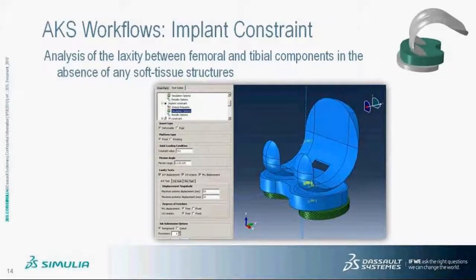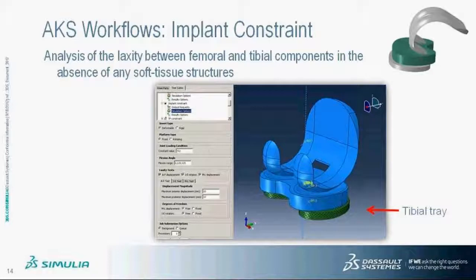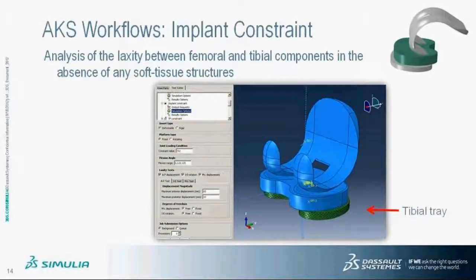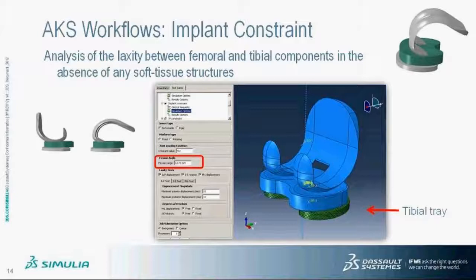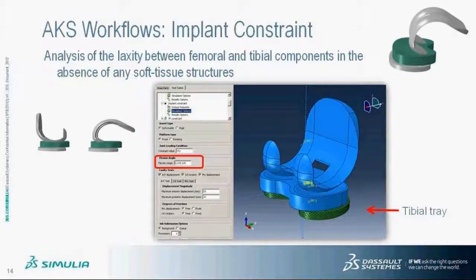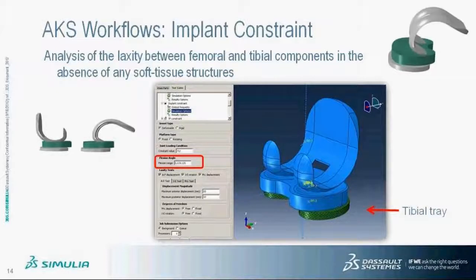The second workflow is the Implant Constraint Workflow — the analysis of laxity between femoral and tibial components in the absence of soft tissue structures. Compared to the previous workflow, one additional component included is the tibial tray, provided by Abacus Knee Simulator for output purposes. The flexion angle here also indicates where laxity tests will be performed — for example, at zero and 120 degrees. A smaller increment means more laxity tests performed at each interval.